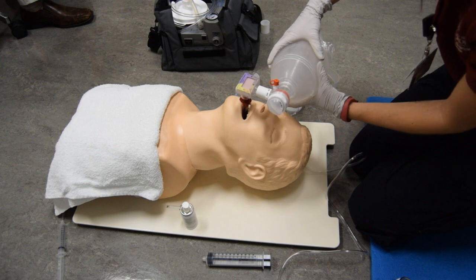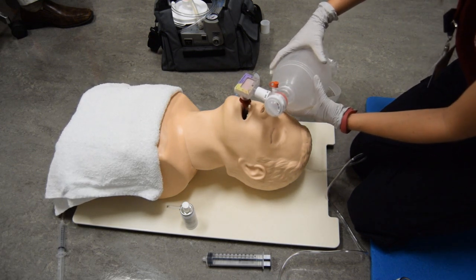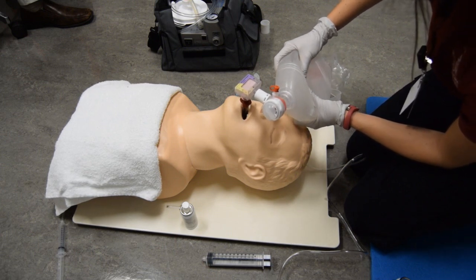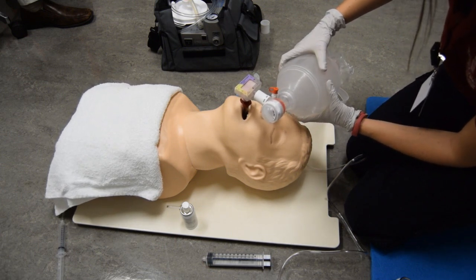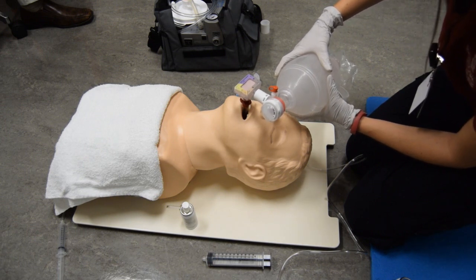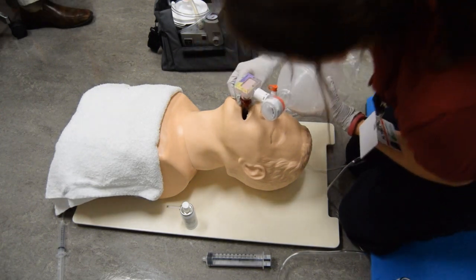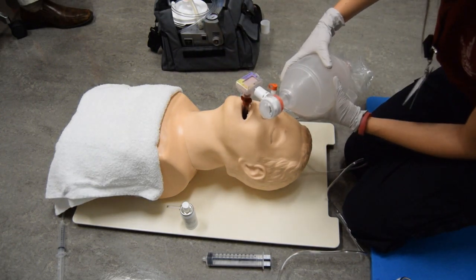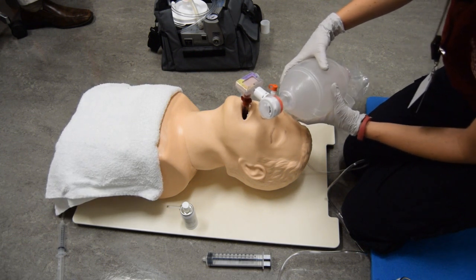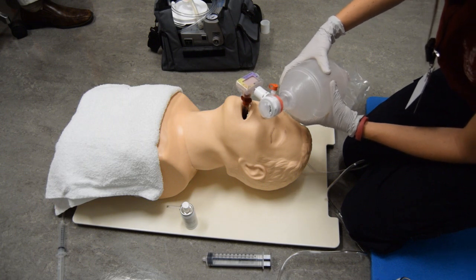Examiner asks the candidate: how would you know if you were delivering appropriate volumes with each ventilation? Looking for bilateral equal chest rise and fall. Secures device and confirms the device remains properly secured. The device is properly secured. Ventilates patient at proper rate and volume while observing capnography, capnometry, and pulse oximetry.